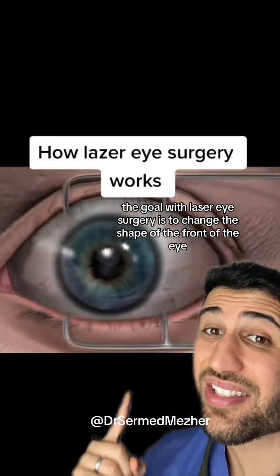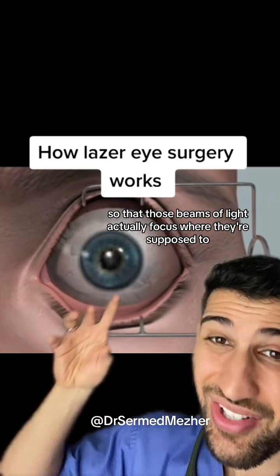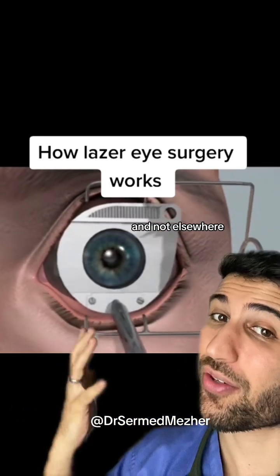So the goal with laser eye surgery is to change the shape of the front of the eye so that those beams of light actually focus where they're supposed to and not elsewhere.